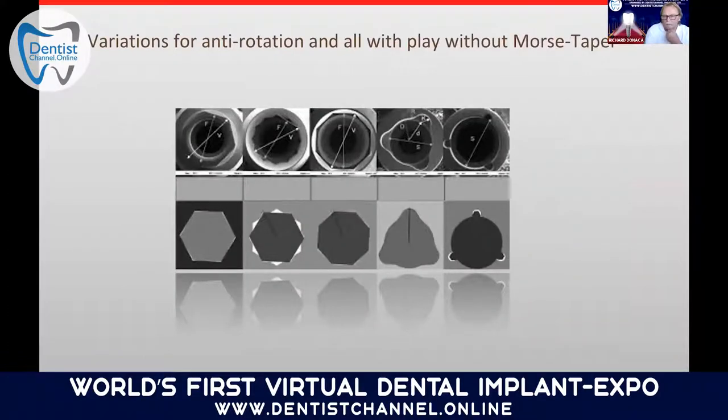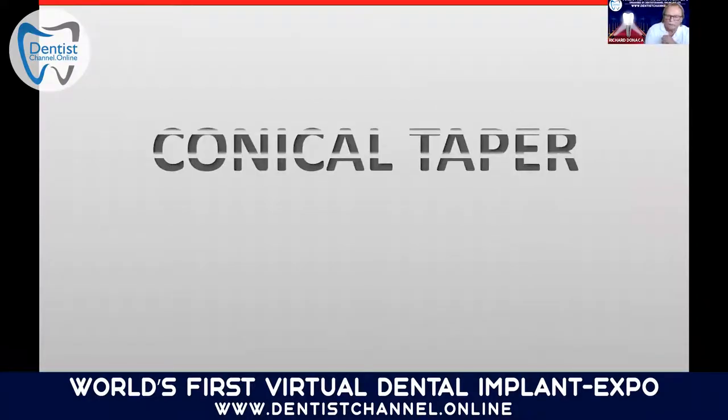We have quite a variation of anti-rotation connections in general on the market, all of which, except for conical connections, do not have a press fit or a technology that actually allows for a bacterial seal. The conical taper is what we're going to promote here today in the general connections.